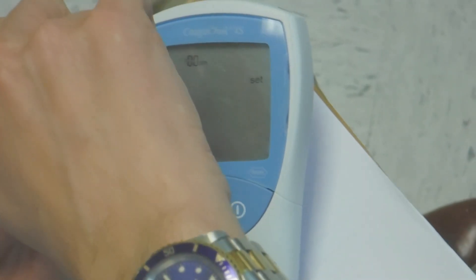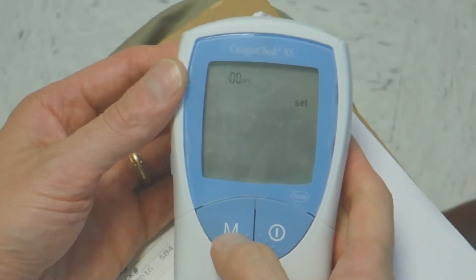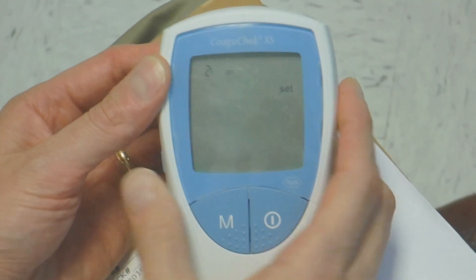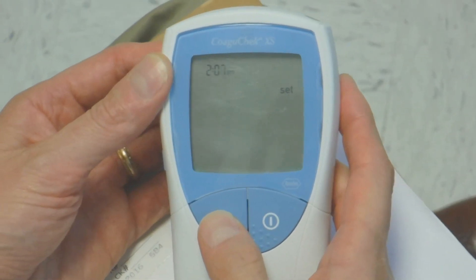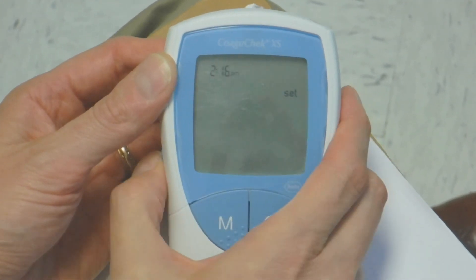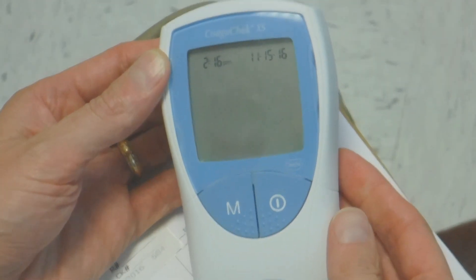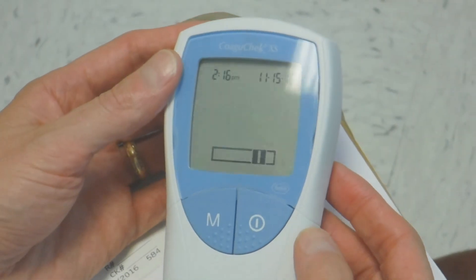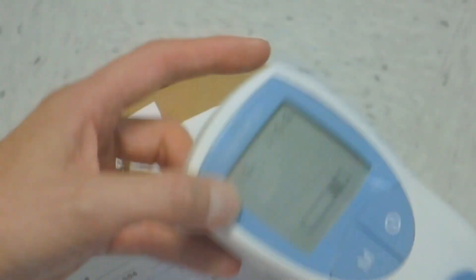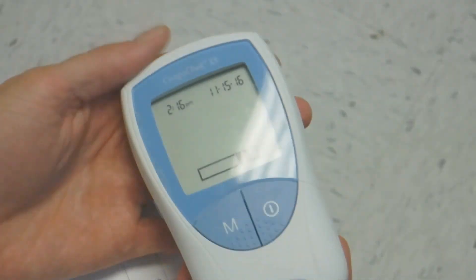The time right now is 2:16. This one looks just like yours. Yeah, it really does. Okay, so now it's telling me it's ready for a test strip. So we put the strip in, and then you can show me how to use this to poke my finger.